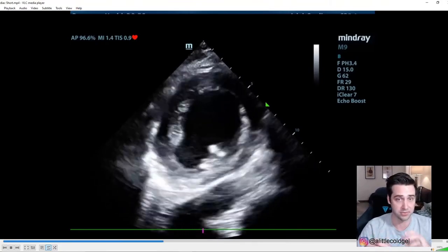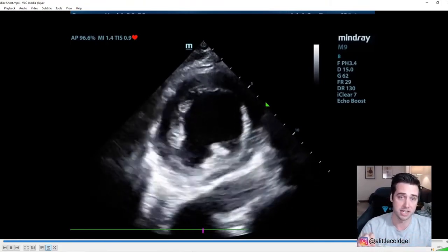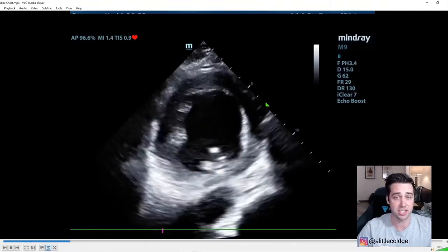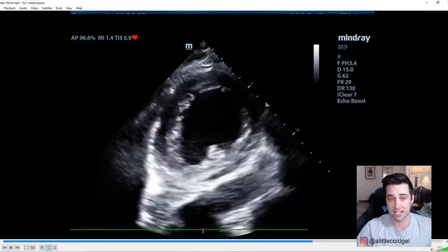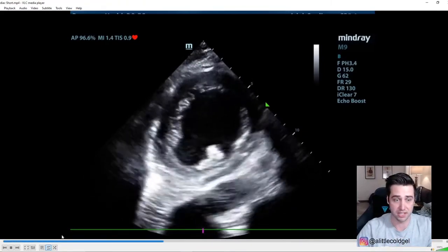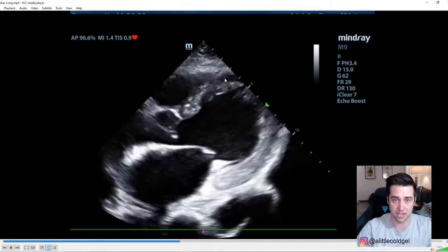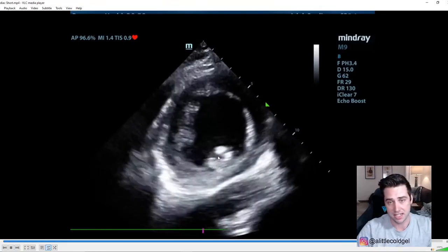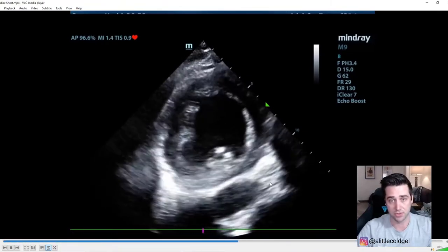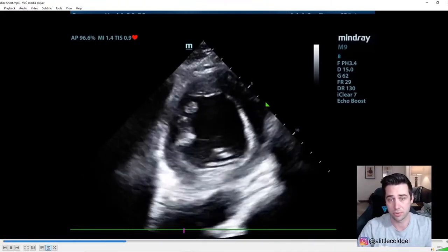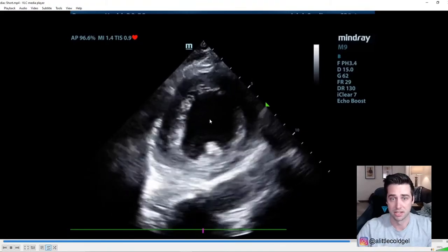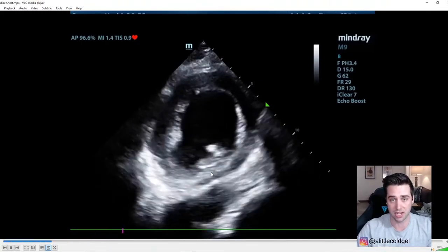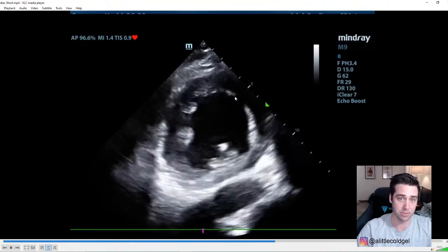This is a parasternal short axis view. When you have that probe next to the sternum with the indicator pointed towards the right shoulder, you rotate it 90 degrees and get the ventricle on its short axis — you can see the entire circumference of the left ventricle. The right ventricle is off to the side, and inside you can see the papillary muscles. To get a good parasternal short axis view, you want to see the papillary muscles, not the mitral valve leaflets.